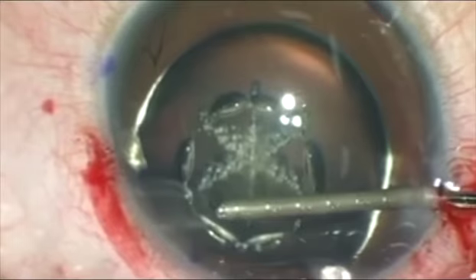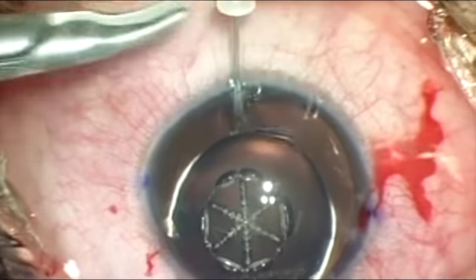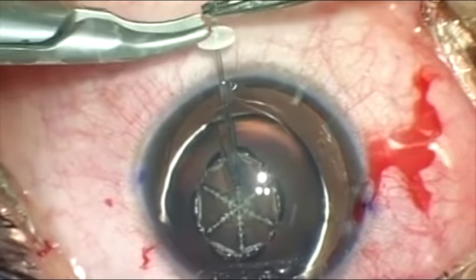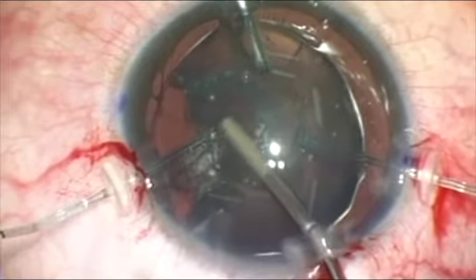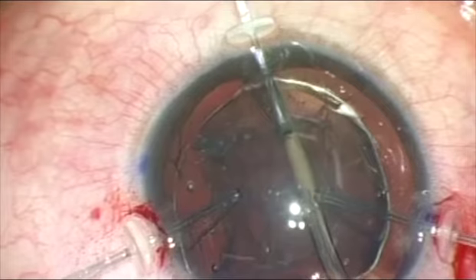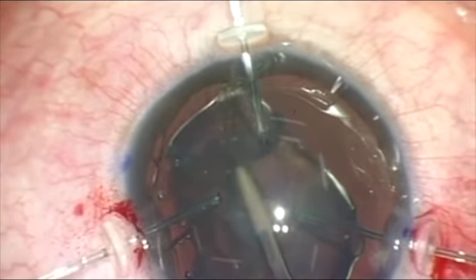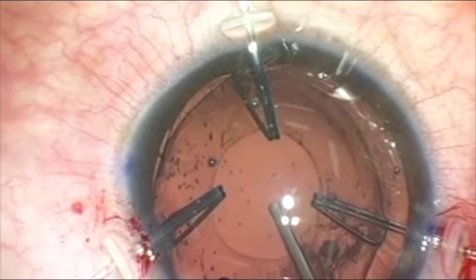You see now the other case where femto laser capsulotomy was being done, and this is the patient with Marfan syndrome, and after removing anterior capsule flap, the bag is suspended on MST capsular hooks, and then dry aspiration is performed with the anterior chamber and capsular bag completely filled with dispersive OVD.